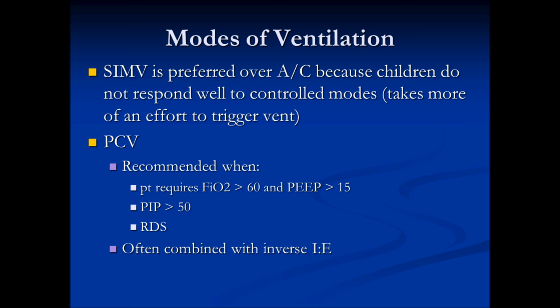And then pressure control is also utilized when we combine it with inverse IE ratio. And that is it for mechanical ventilation of neonates and pediatric patients.